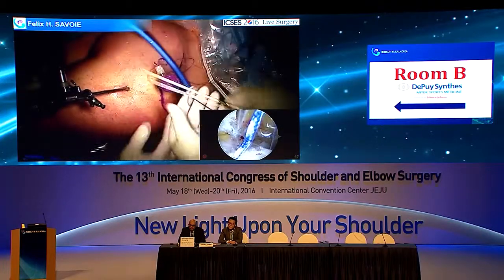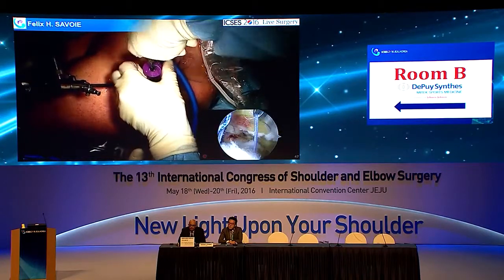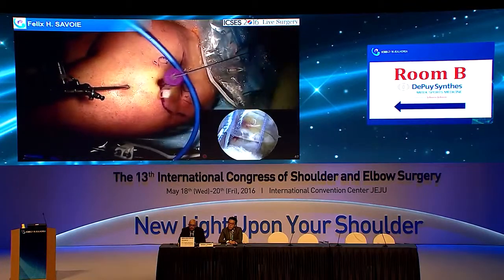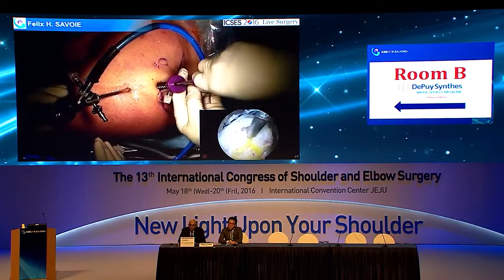So what I'll do is I'll look in the joint or look in the bursa, and then I'll take out all the part that's frayed and see on my post-op x-ray whether I changed the angle. And actually we do. So I kind of bevel it up a little bit. I try to stay out of the deltoid.